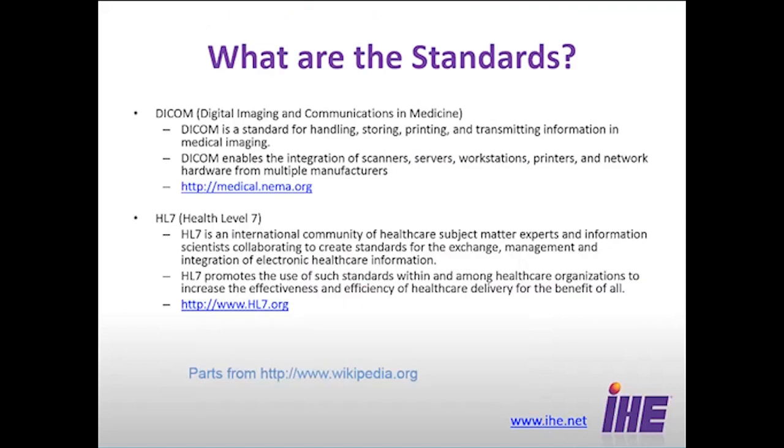And I mentioned again that it's a refinement of the standards. The two standards, as I said before, are DICOM and HL7. The reason we may say DICOM needs some refinement, and I don't mean to pick on DICOM, after all, I am a member of the DICOM Working Group 7 for radiotherapy. I strongly believe in supporting DICOM, but I'm sure if you've been in the clinic, you've seen situations where you have two systems that are DICOM compliant, but yet don't fully communicate with each other. They aren't truly interoperable. And those are the type of things we look at in IHE. Those are the type of problems we try to solve.